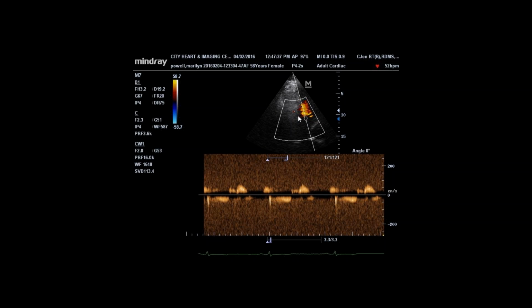You're across the mitral valve. Transducer or probe is right there. So it suggests that there is something flowing from the left ventricle across the mitral valve into the left atrium. So this is mitral regurgitation. Very tiny, but it suggests mitral regurgitation.